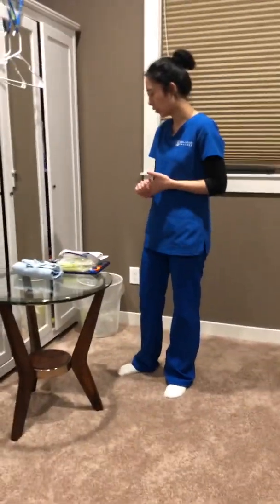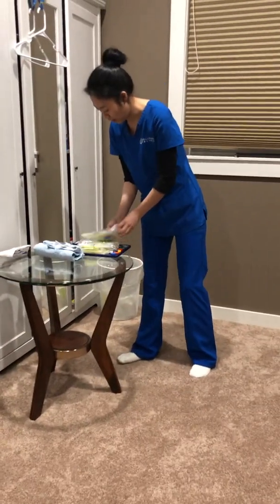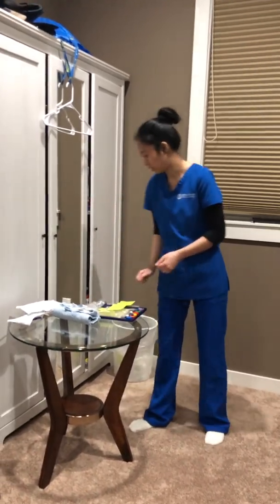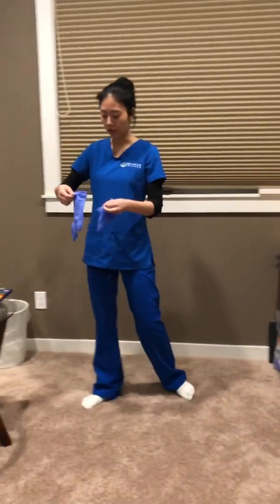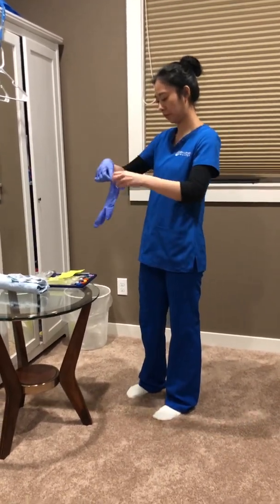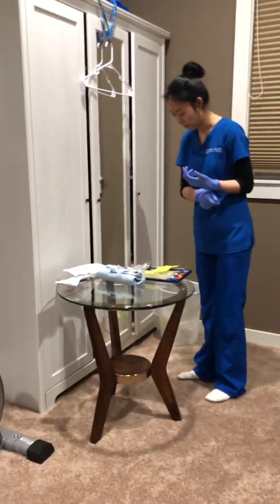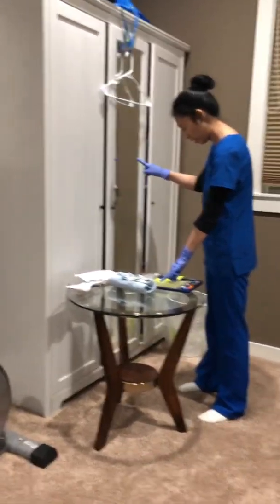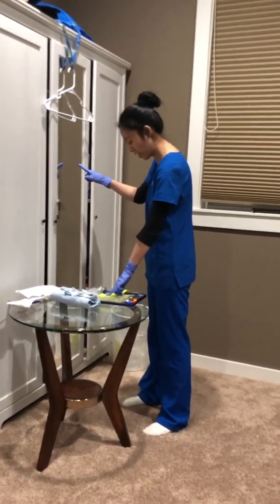Alright, so I'm going to prepare you for the IV medication. Let me put everything here so that I'm good. Then hand hygiene. Put on gloves. Before I give the medication, I check the MAR again to see it is the right patient, right time, right medication, right route, and right dose.